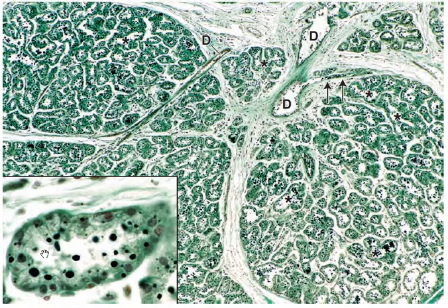The lipid first appears as small droplets within the epithelial cells. These droplets become larger and ultimately are secreted into the alveolar lumen along with milk proteins. The milk proteins are present in small vacuoles in the apical part of the cell but cannot be seen by light microscopic methods. They are secreted by exocytosis. The lipid droplets, in contrast, are large and surrounded by the apical membrane as they are pinched off to enter the lumen. Thus, it is an apocrine secretion.